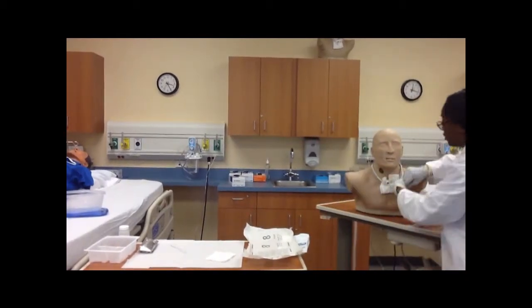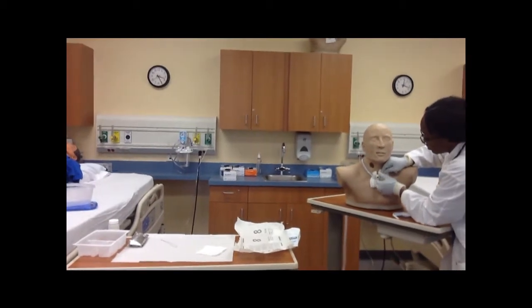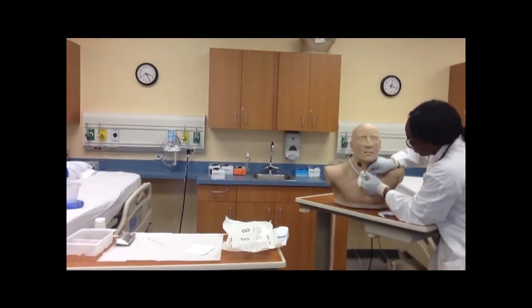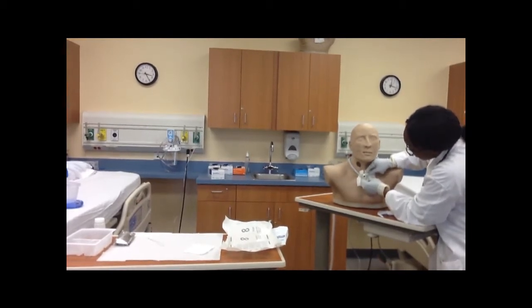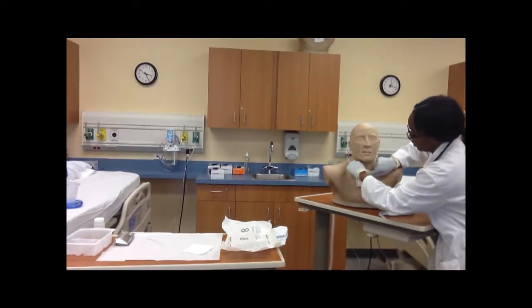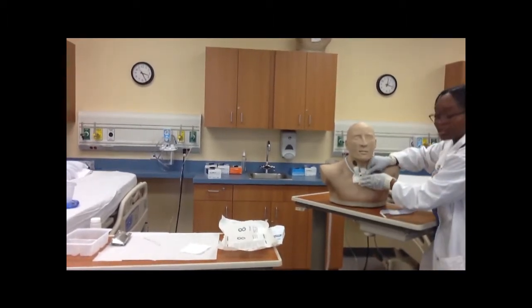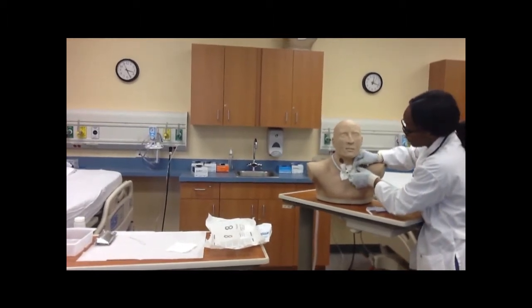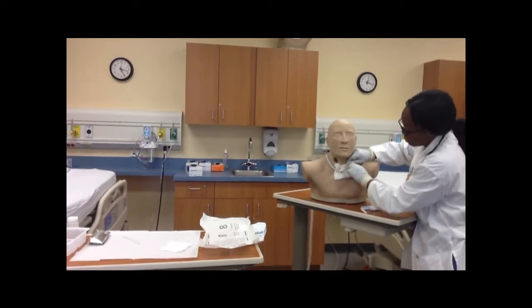It's going to go around here so you can have a better view. Making sure everything's intact.